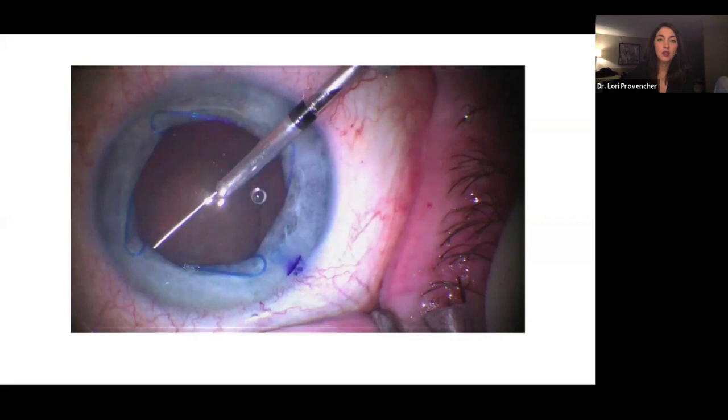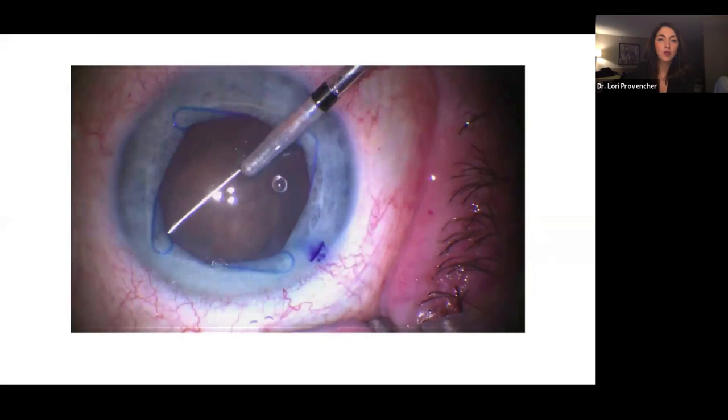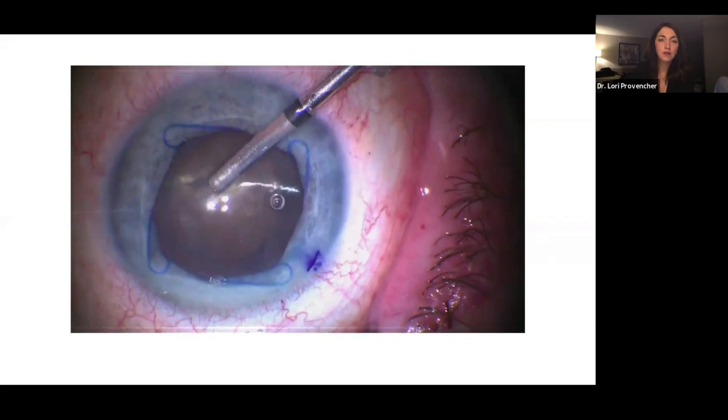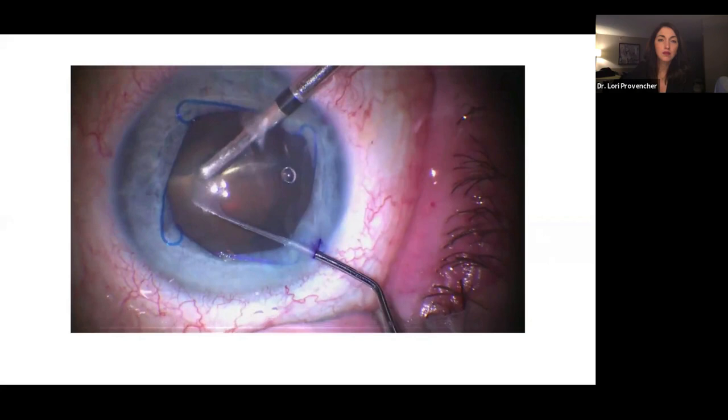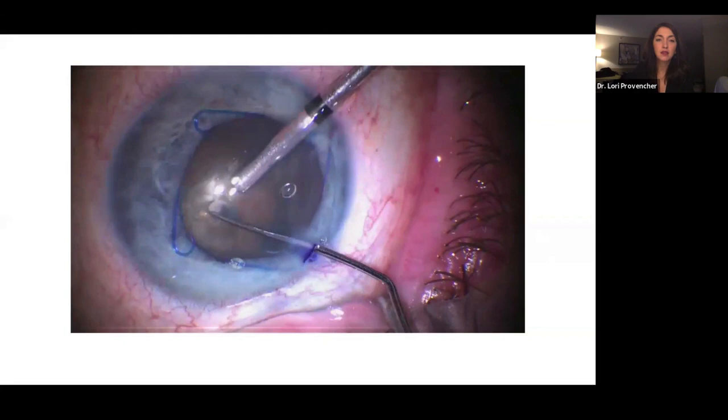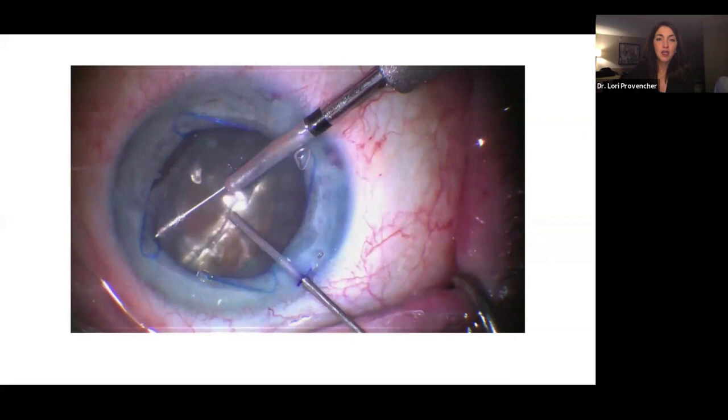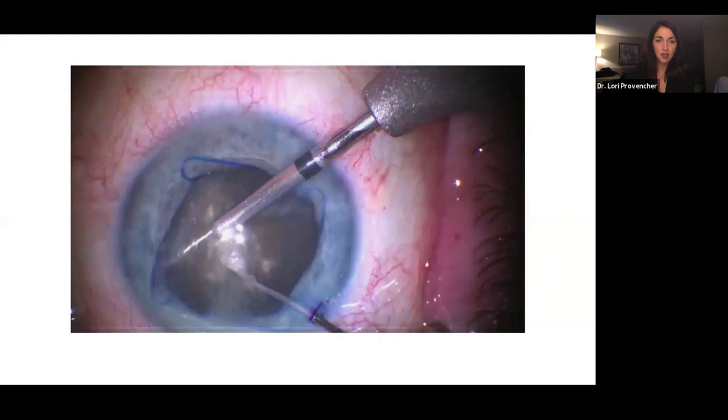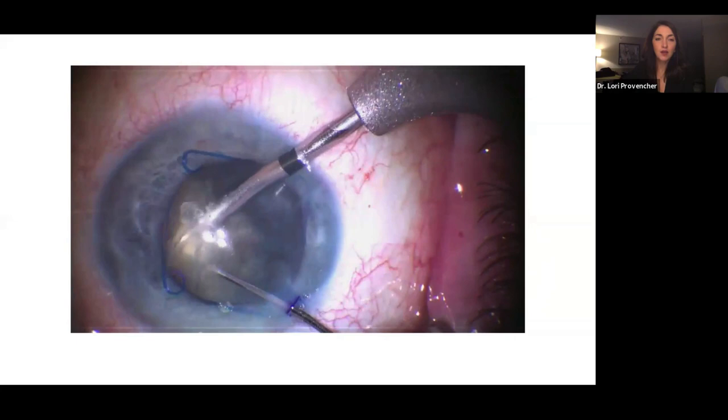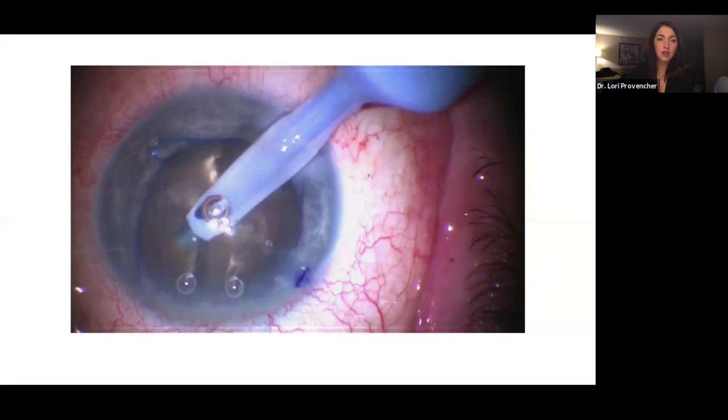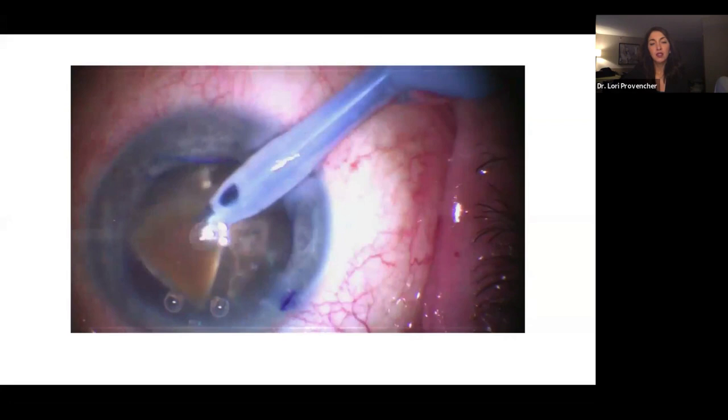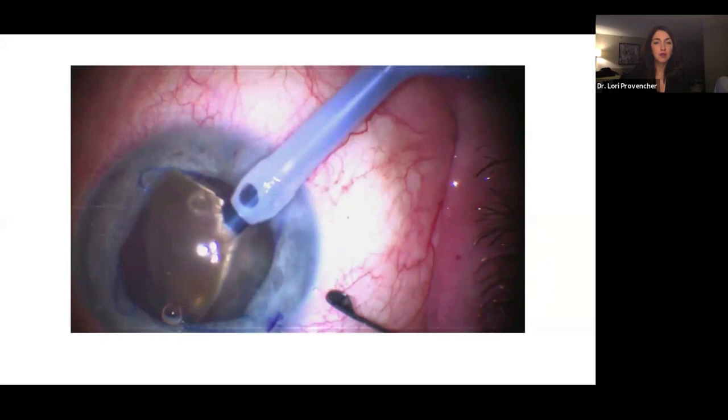This is early in my surgical training. And we're using the MyLoop here to get this really dense lens into several pieces so that I can emulsify them safely. We're spinning the MyLoop here just past the midline. You'll see that gold flash. That's the back part of the loop. And then I'm going to pull the snare in here, using a second instrument to keep the cataract in the bag. And now we've got the lens in four quadrants. And they can be pulled out of the bag and emulsified. And as you can see, this is a really dense lens with a really leathery plate.